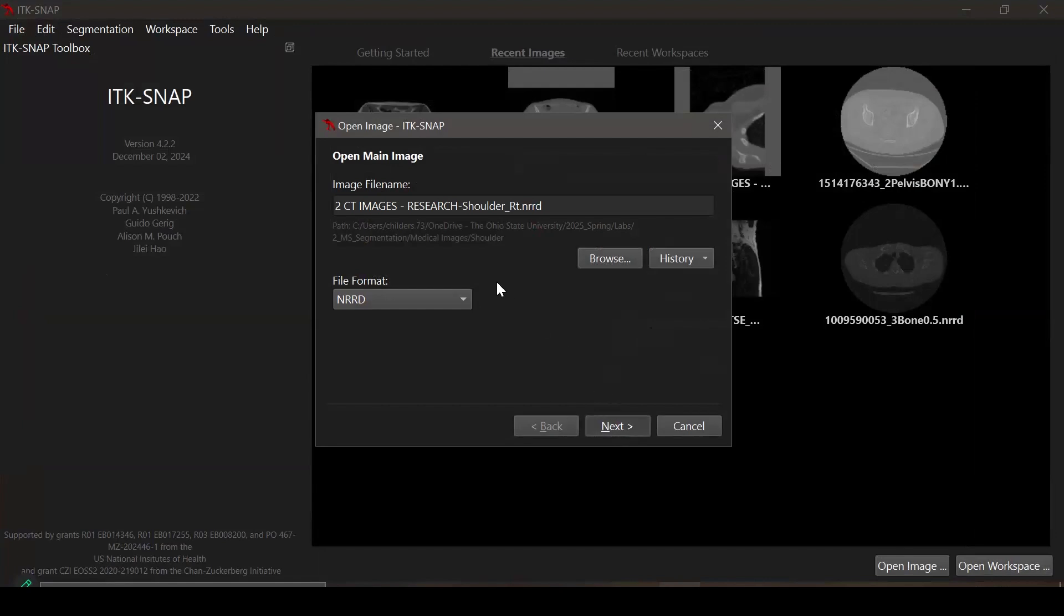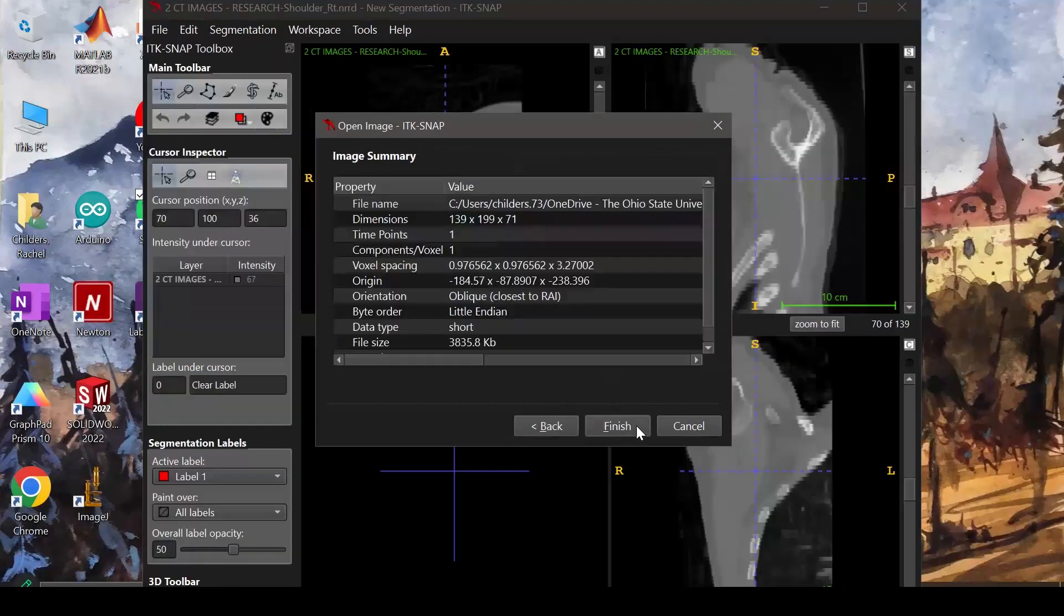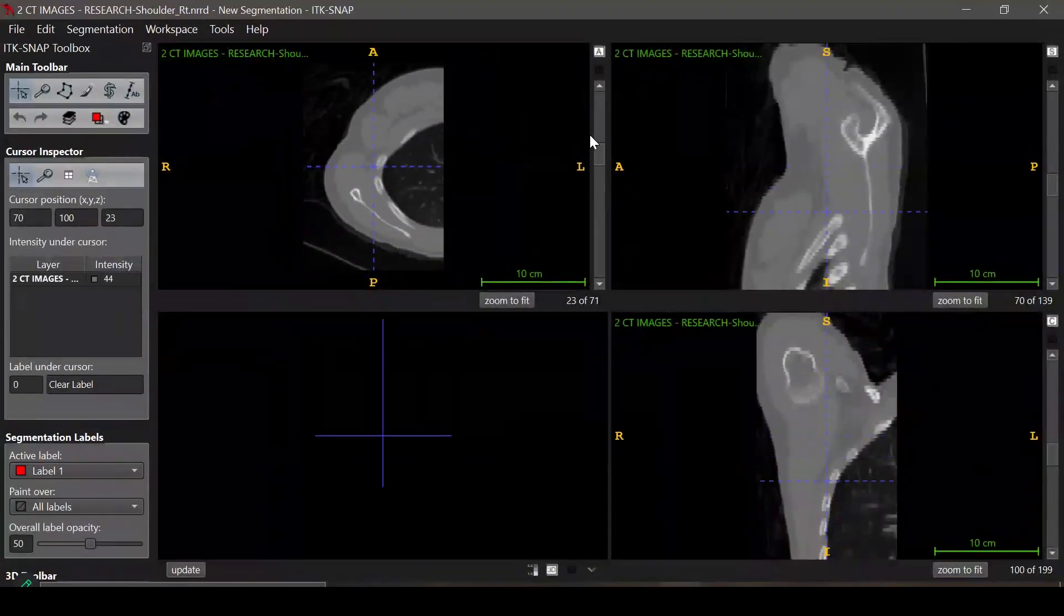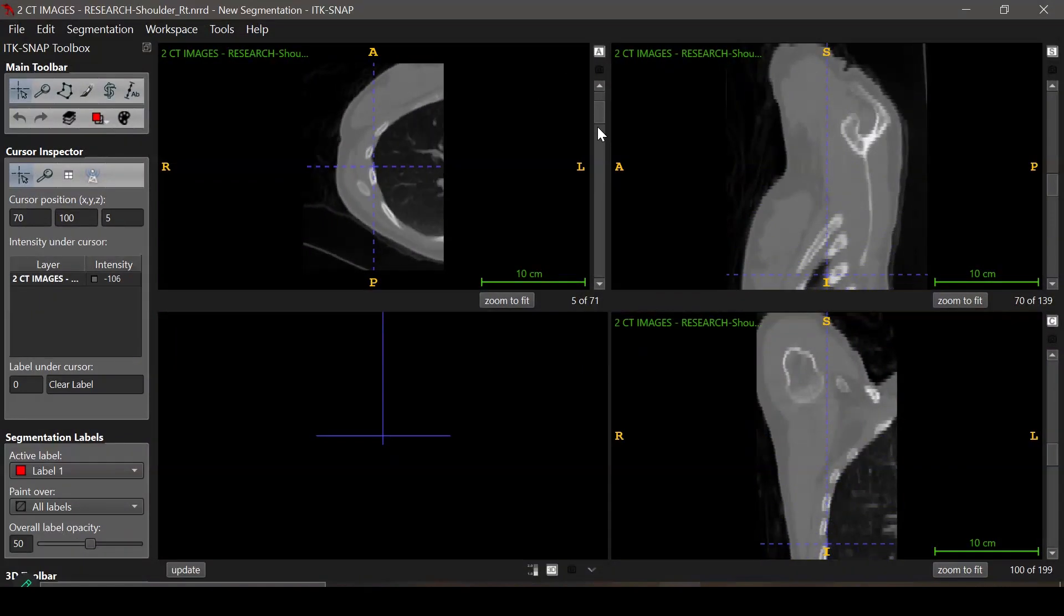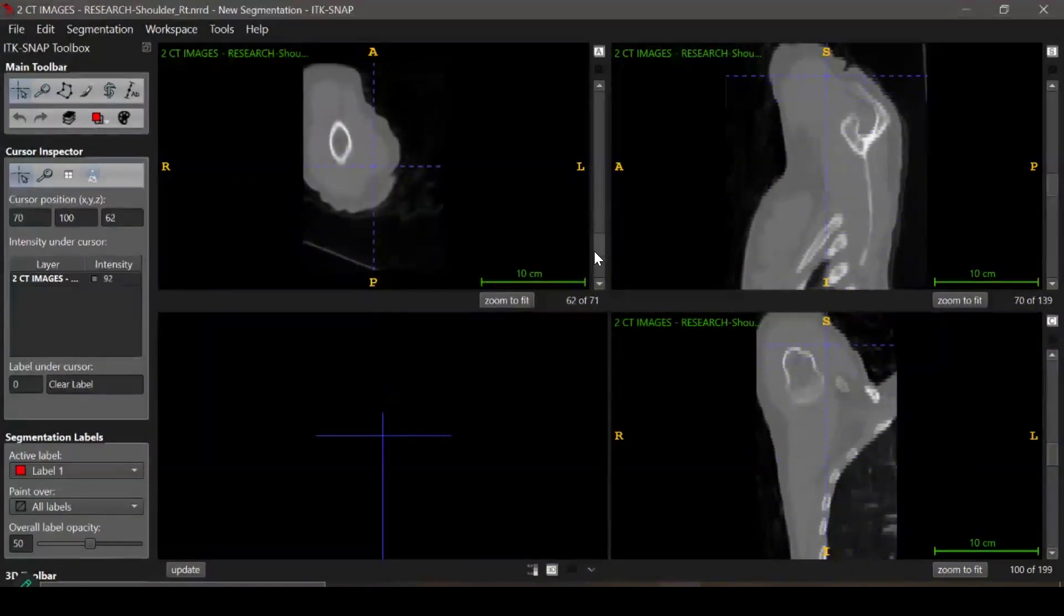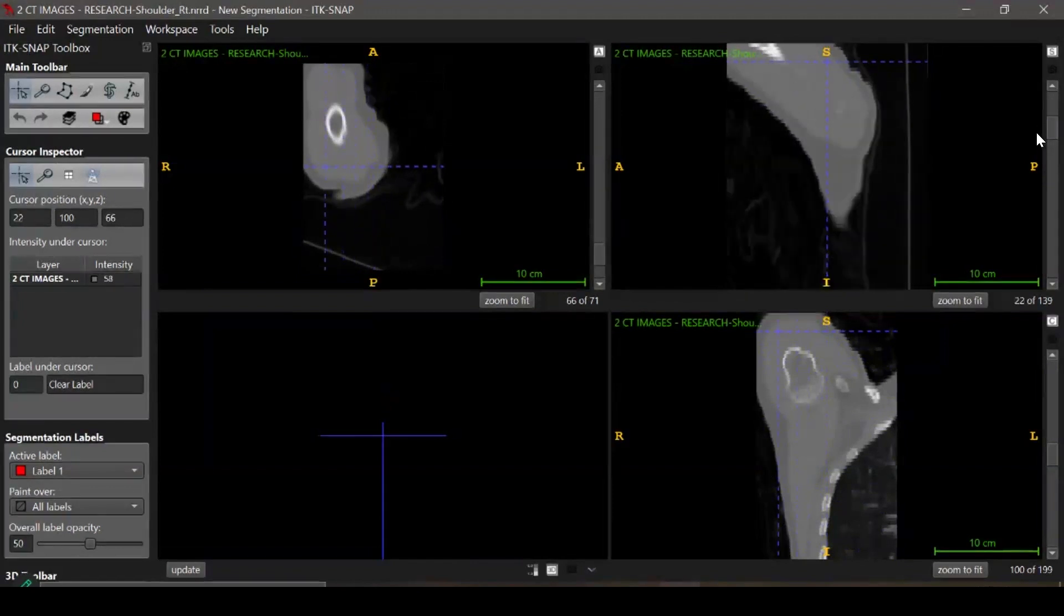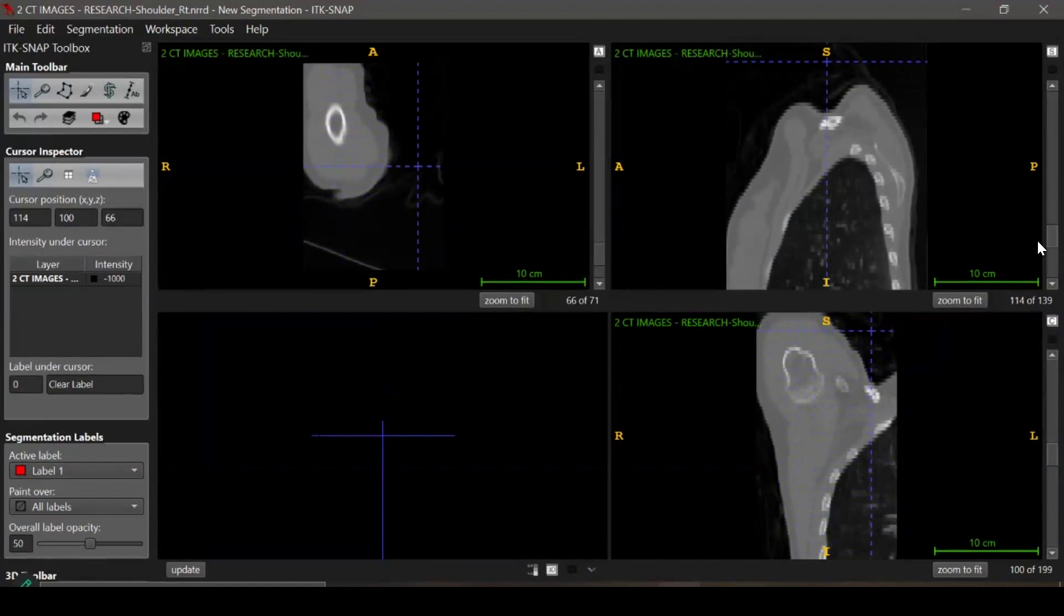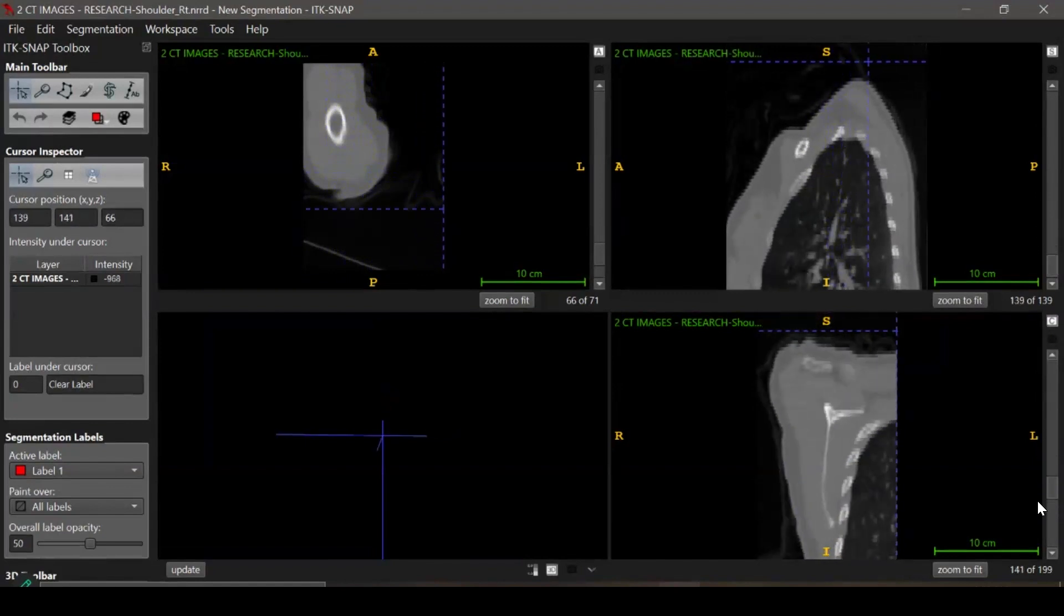After you've loaded in the image, I recommend that you orient yourself to the image slices. You're going to notice that there's three different panels in view. The first one on the upper left-hand corner is the axial view. The one I'm scrolling through now is the sagittal view. And the one in the bottom right-hand corner is the frontal view.